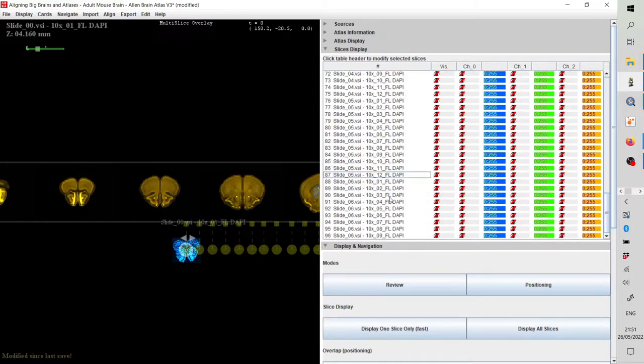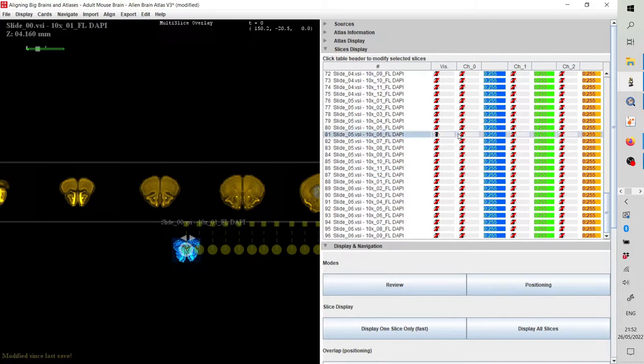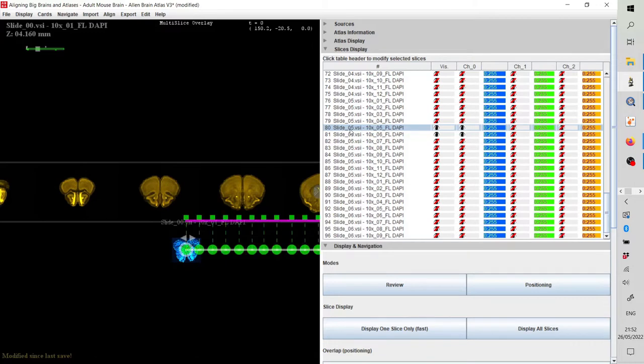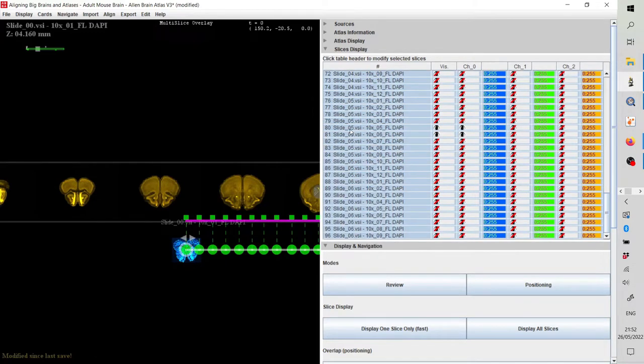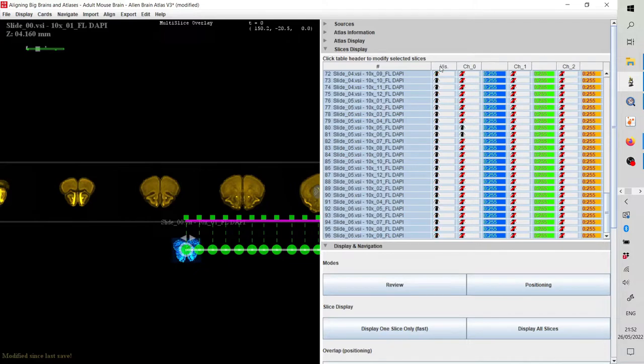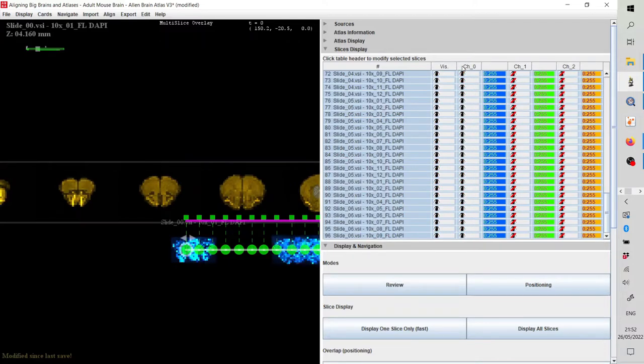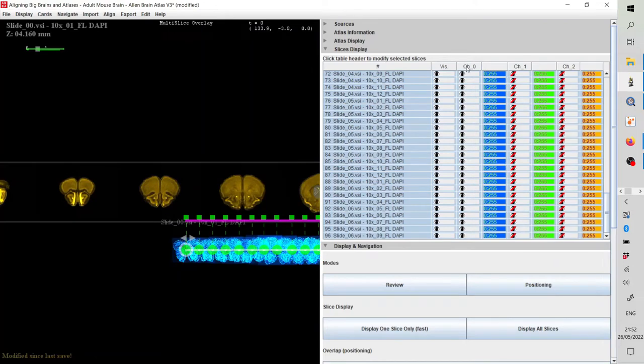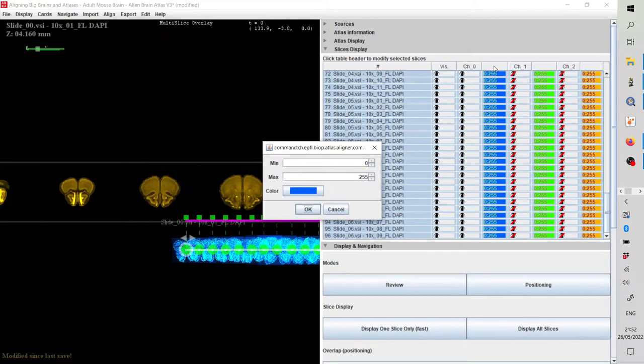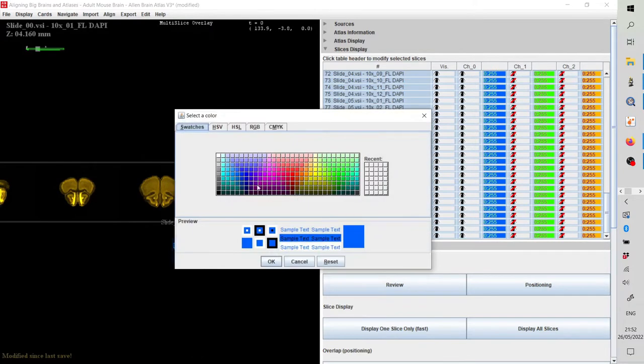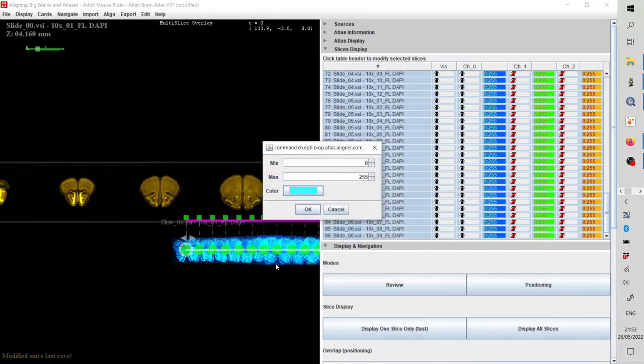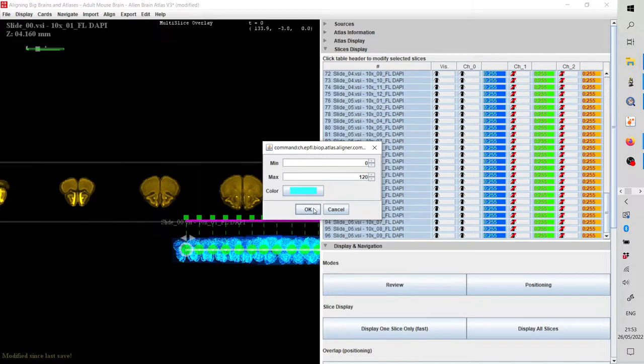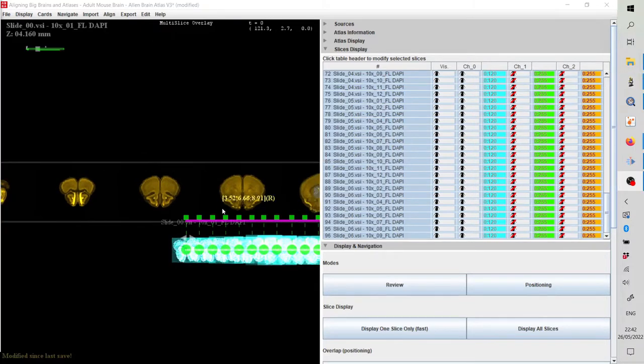This part now done, I will unhide all sections. I could either click on the little icons for each section individually, but that's tedious. Instead, I select all slices with Ctrl A. Maybe it's command A on a Mac. And I click on the header of the table for the properties that I want to change. So now all slices are visible for the first channel. I can also change the color as well as the brightness of the selected sections by clicking on the header at this location. I can choose the color. And I prefer cyan because blue is really hard to see. And I will lower the max value to 120 in order to make them really bright.